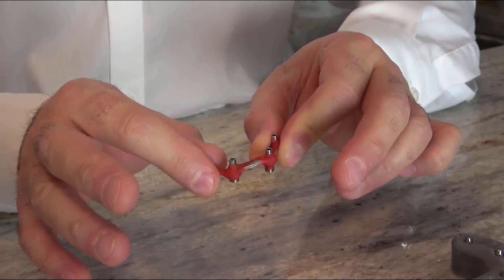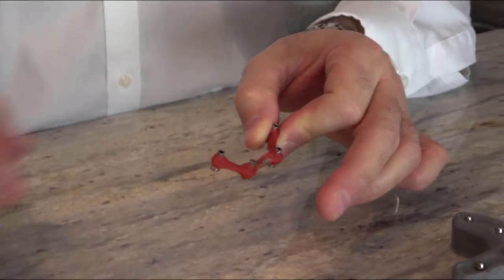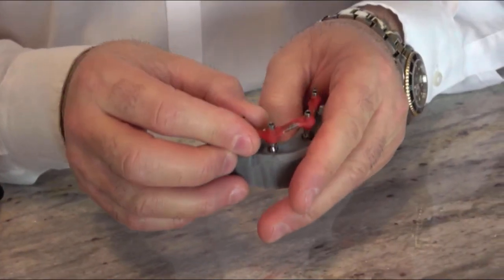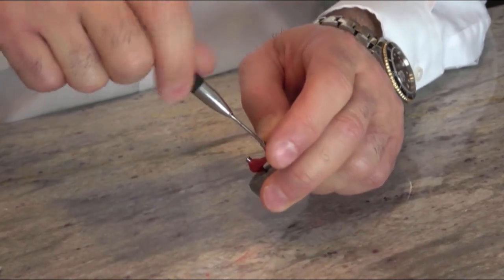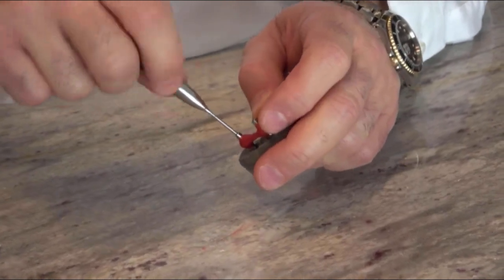Add more material with either Duralay or light curing to the areas that move. Then screw it back in the patient's mouth and let it set - either light cure or self cure it in place. Then do the test again.